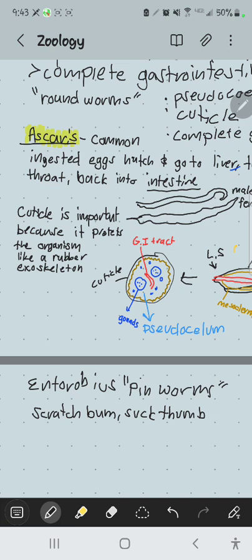And then there is this device. If you go to the doctor and you think your child might have pinworms, they give you this little sampling device. It's a little plastic paddle that has sticky glue on the outside. When you're investigating why your kid's so itchy and wiggly, you take this and stick it on the child's rear end, and it will collect not only worm eggs, but maybe even some female worms that are sticking out. Then they send it to a diagnostic laboratory to verify that the child has pinworms.